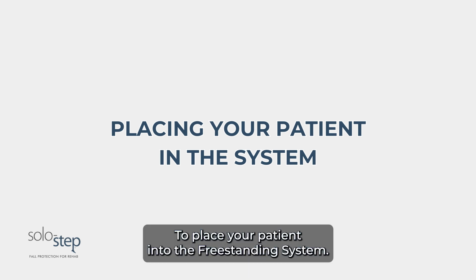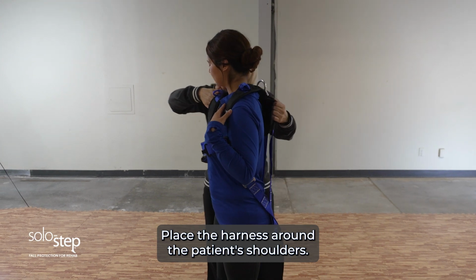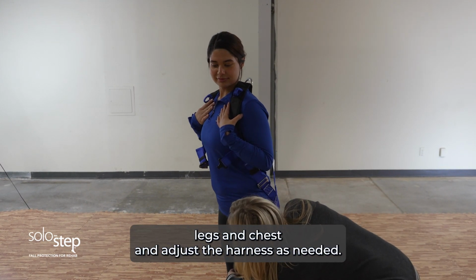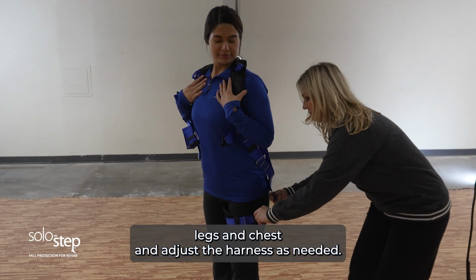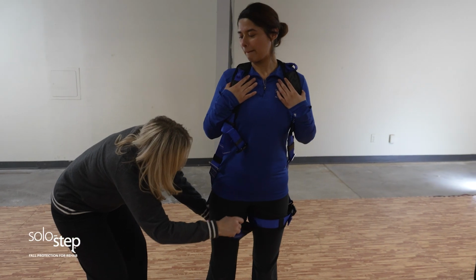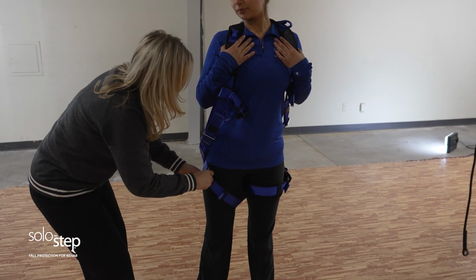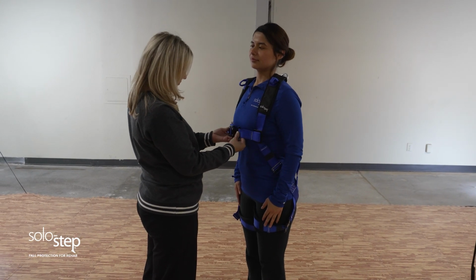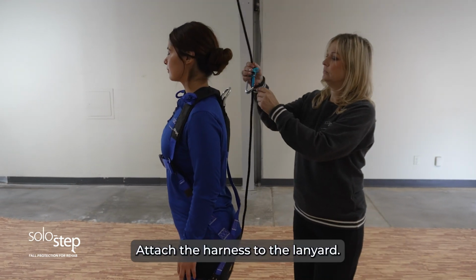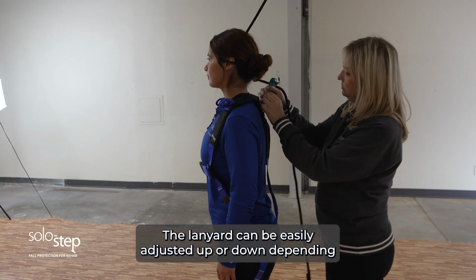To place your patient into the freestanding system, place the harness around the patient's shoulders. Buckle the harness around the patient's legs and chest, and adjust the harness as needed. Attach the harness to the lanyard. The lanyard can be easily adjusted up or down depending on the patient's height.